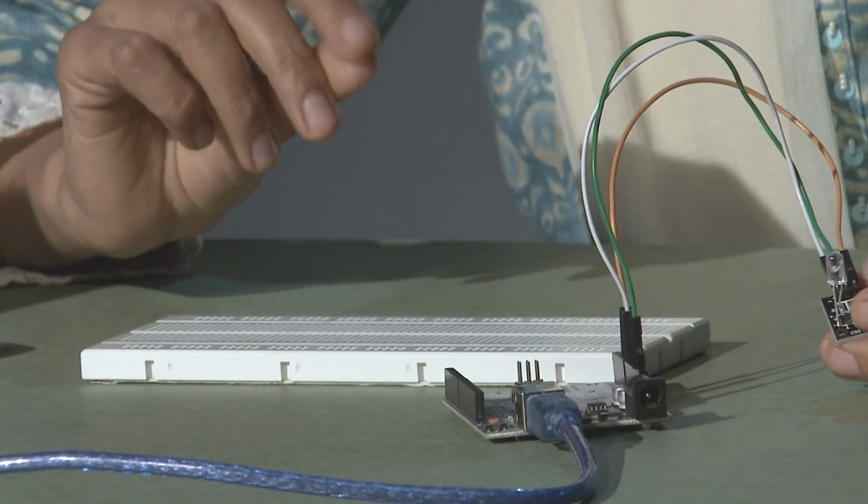If you want to further create some scenario with maybe LEDs or anything else, you can use a breadboard to create that sequence of pulses with the help of an LED. But in my case, I will be using it directly on a serial plotter.